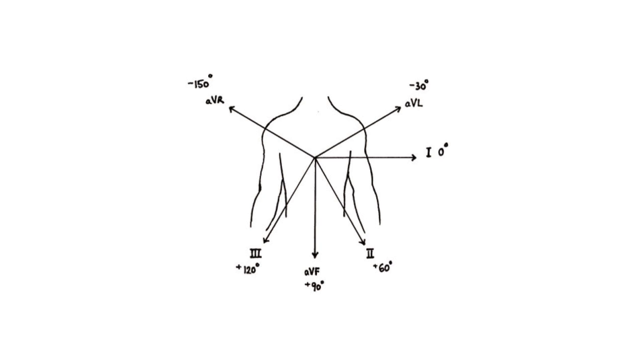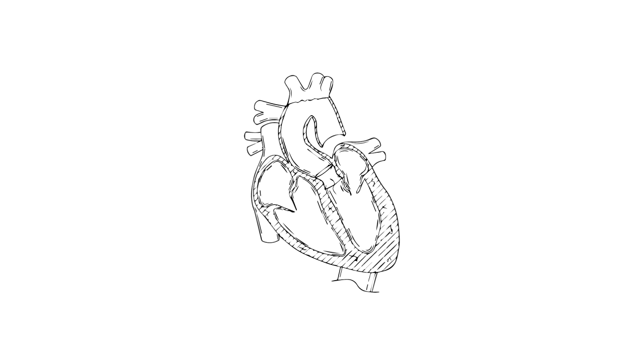The electrocardiogram, or ECG, or EKG, is a measurement of tiny potential differences on the surface of the body that reflect the electrical activity of the heart. These potential differences, or voltages, are measurable on the body's surface because of the timing and sequence of depolarization and repolarization of the heart. Recall that the entire myocardium is not depolarized at once.